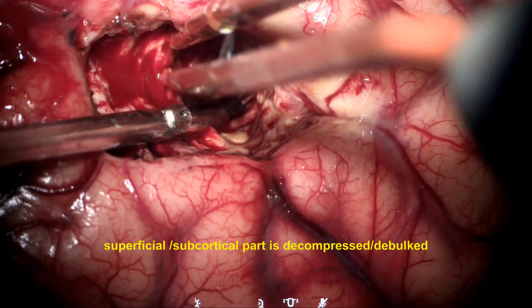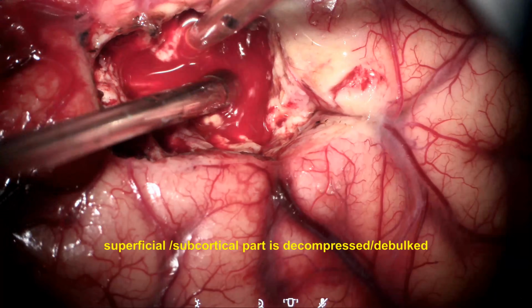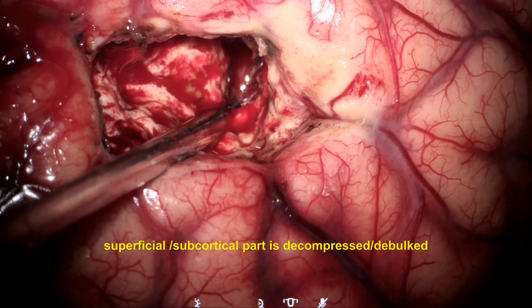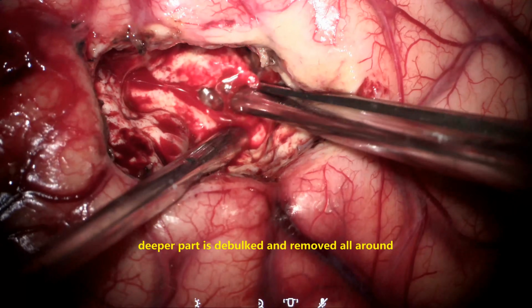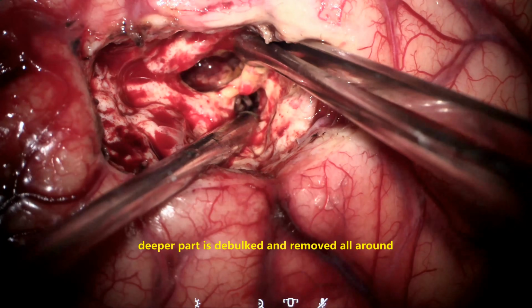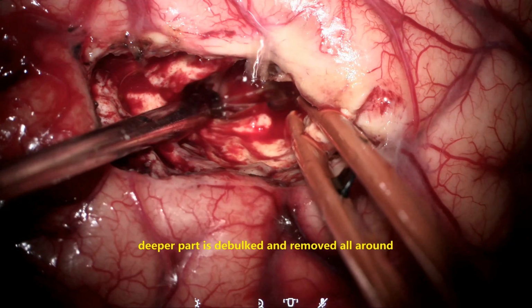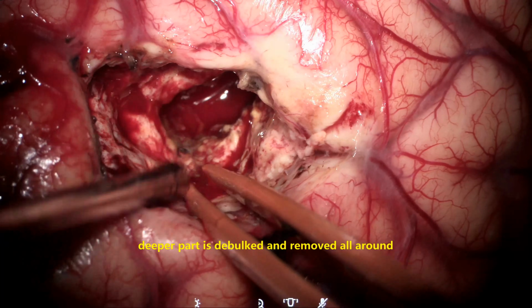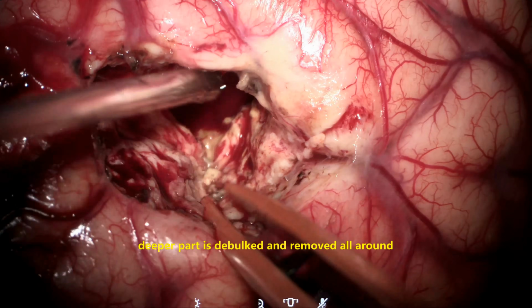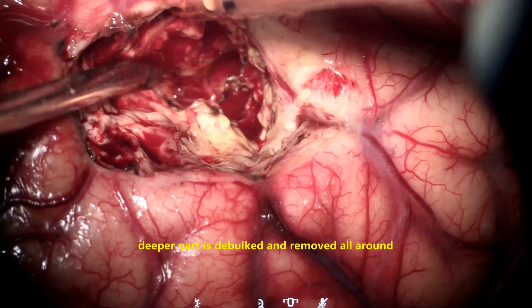Medially, it gets a blood supply from the anterior cerebral artery deep cortical branches. Inferiorly, it gets blood supply from the anterior choroidal artery and posterior communicating artery, which supply the deeper parts. This needs to be understood, and we need to coagulate and achieve hemostasis at every stage.